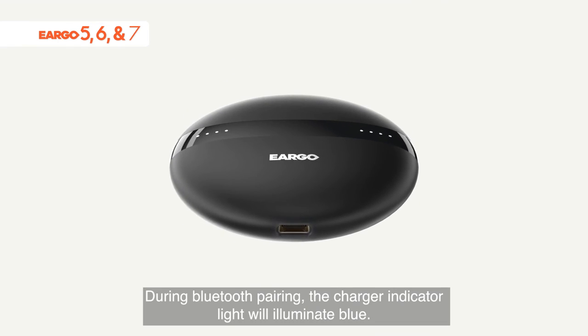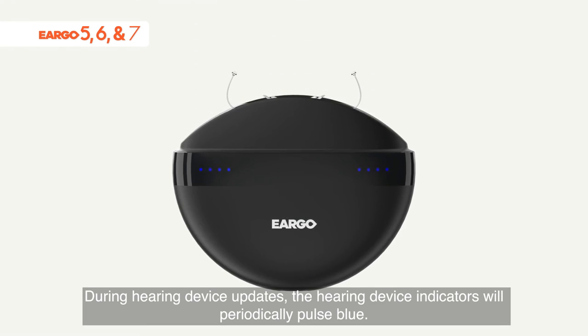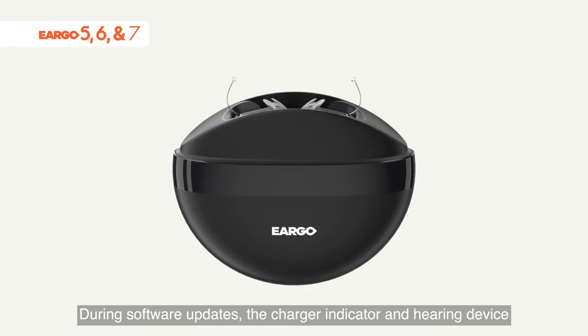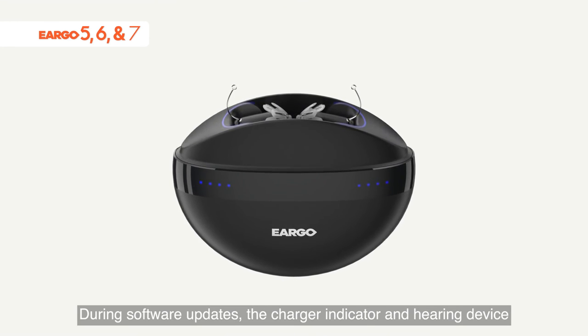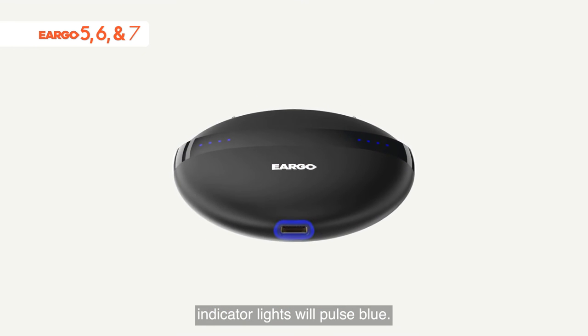During Bluetooth pairing, the charger indicator light will illuminate blue. During hearing device updates, the hearing device indicators will periodically pulse blue. During software updates, the charger indicator and hearing device indicator lights will pulse blue.